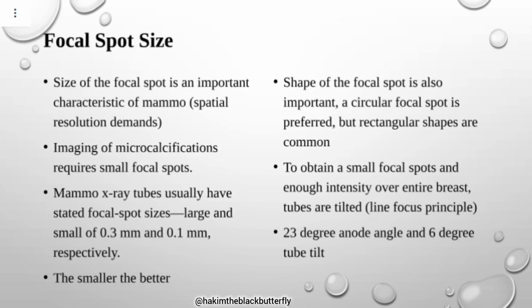To obtain a small focus spot and enough intensity over the entire breast, tubes are tilted, which we call the line focus principle.